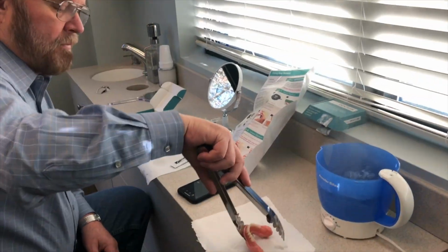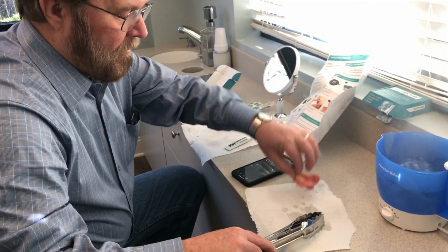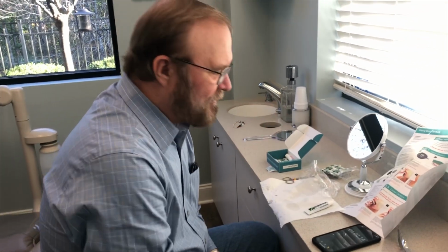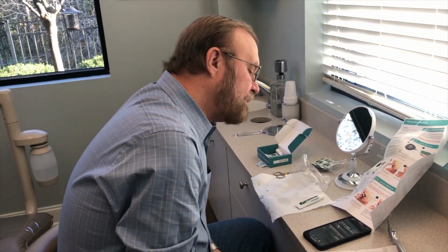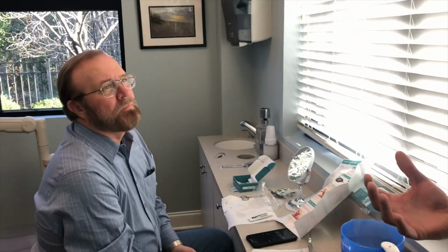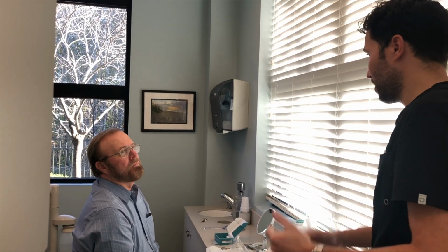I just wanted to show the patients how to get back to seeing the dentist, and your time is valuable. The instructions basically give you exactly what to do at home. We want to restart our timer for the minute cooling. When I size these for patients in the office, I send the instructions home with them in case they need to refit. Also, some of our patients have loved ones in assisted care facilities, and it's just too much for them to come in for multiple visits to a dental office. So it's like, here you go, here's a set, try to fit it in the room there, and if you can't get it done, we'll bring them in.